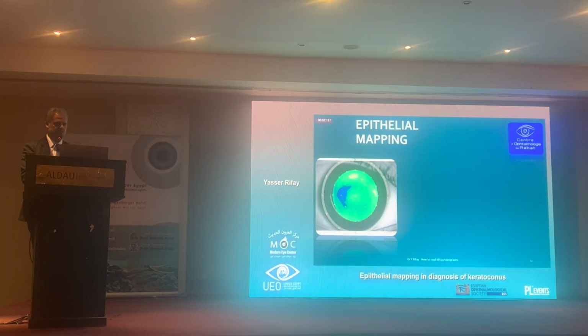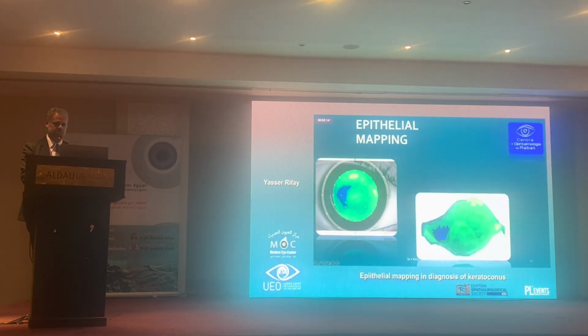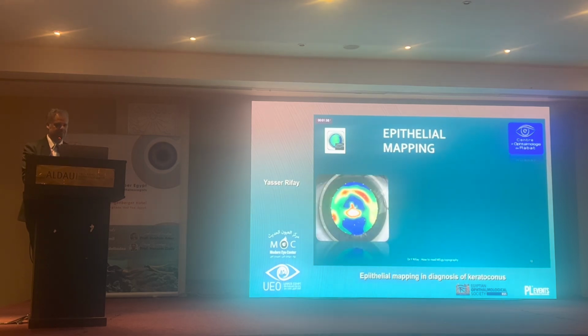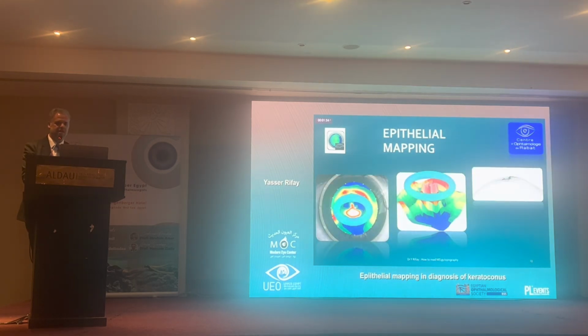Another case, we have here this spot, and there is a scar. When we have a haze after cross-linking, after any other surgery, after PRK, we cannot rely on epithelial mapping. So we can rely on epithelial mapping when the cornea is perfectly clear. Another case, the same.